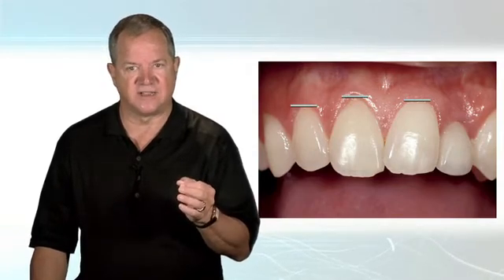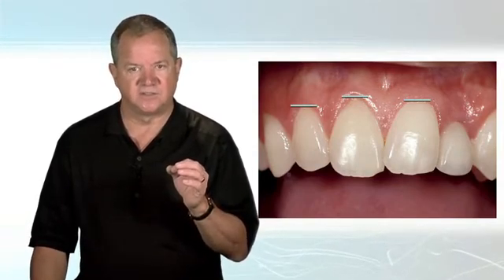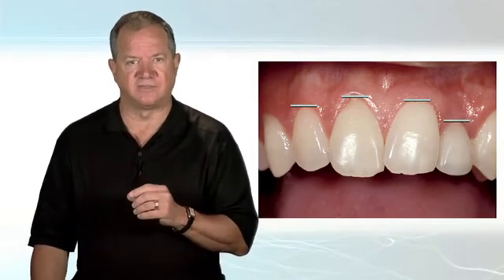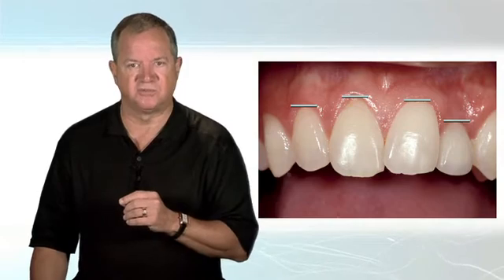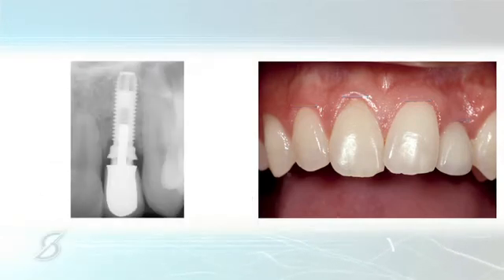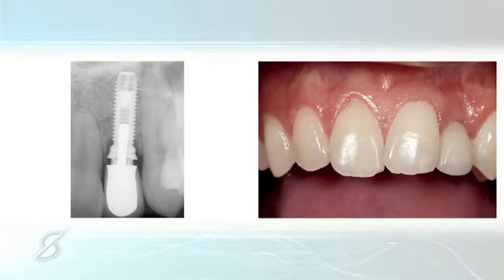So there's our problem. You look at the gingival levels on the two centrals, they're nice and even. But you look at the gingival levels on the right lateral incisor and on the implant, and there's several millimeters difference between them. The crown length of that left lateral implant is at least 2 millimeters, 2.5 millimeters short of the right lateral. Now, when we take a look, the other interesting thing about this case is obviously the crown didn't get seated completely either, which probably also impacted the fact that we have less movement of tissue apically than we would have liked.